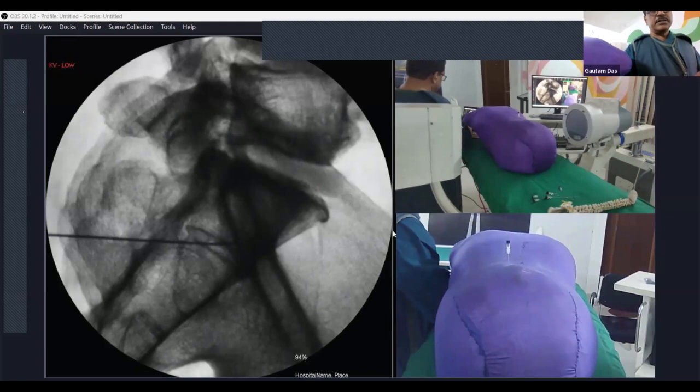You see, this is your fused lamina. For the sacrum, the laminas are fused. So this is the sacral lamina. The vertebral body is from here till here, again the fused vertebral body. So this is your S1, this is your S2, and this is your sacral canal. The white area is your sacral canal.